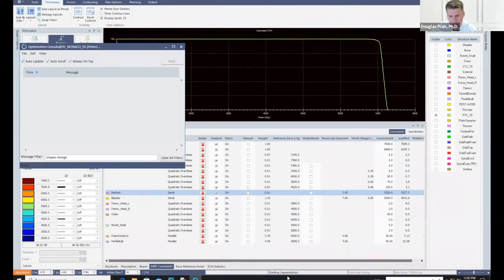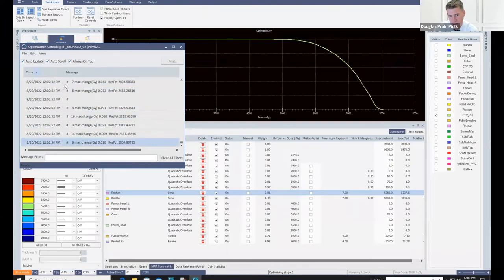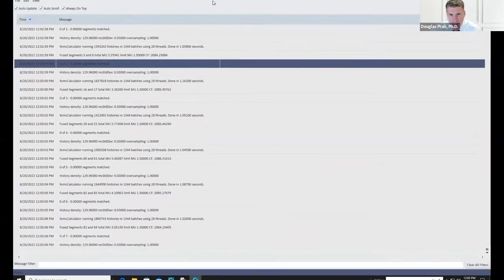So I believe you can see here, this is still kicking off. It's still segmenting. Let's see what's going on here. You can see it's spooling up the number of segments. Once these batches get calculated, then it'll start doing its stage two optimization. So now it looks like we went through that initial calculation and now it's moved on. A couple of things I can talk about while this is running.